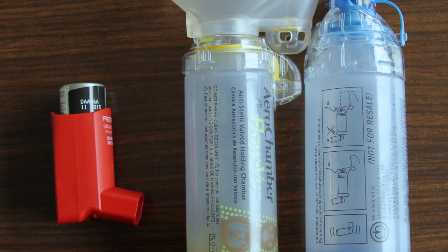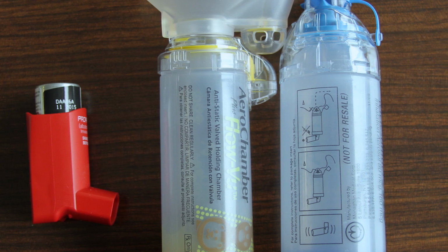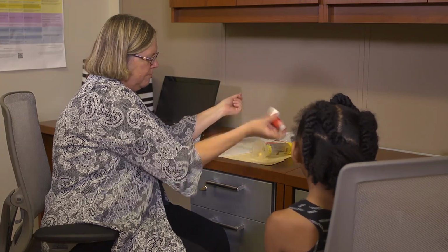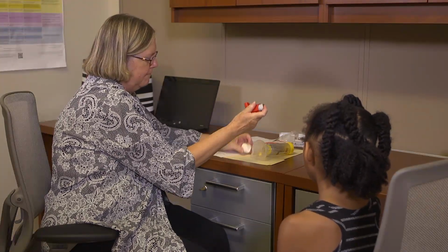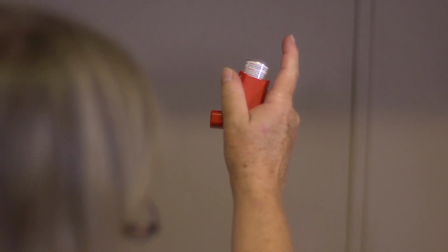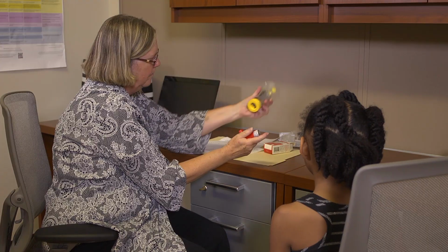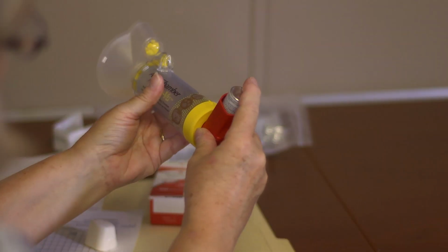When the MDI is brand new or has not been used for a while, the medication may separate from the other ingredients in the canister and the metering chamber. Shaking the MDI will mix the ingredients in the drug reservoir, but may not produce enough turbulence to reblend the ingredients in the metering chamber. Priming, or releasing one or more sprays into the air, ensures your next dose will contain the labeled amount of medication.